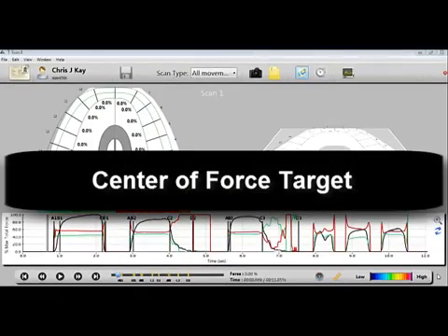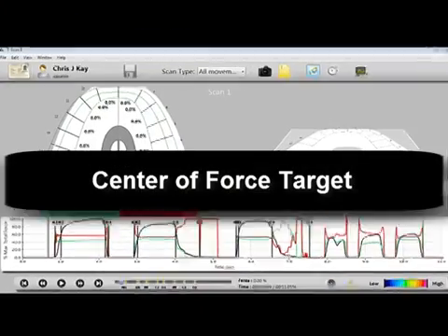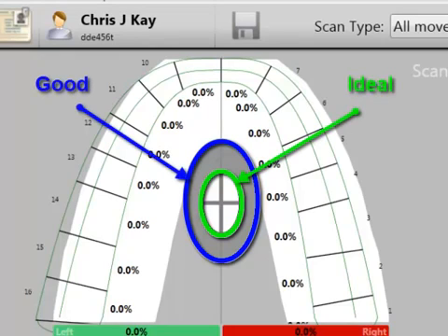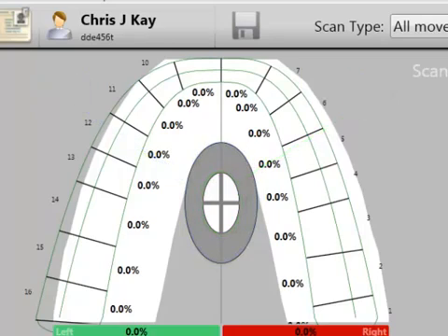The white and gray circle in the center of the 2D window is the Center of Force Target. This dual elliptical target represents the ideal location of the center of force for a maximum intercuspation closure and acts as a guide with respect to a normal occlusion.